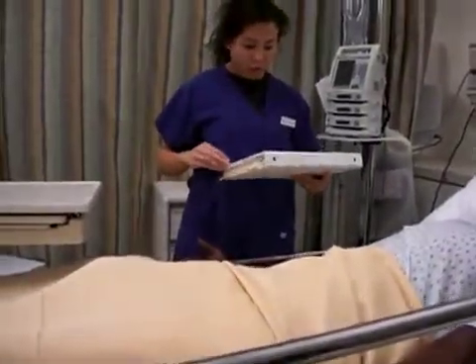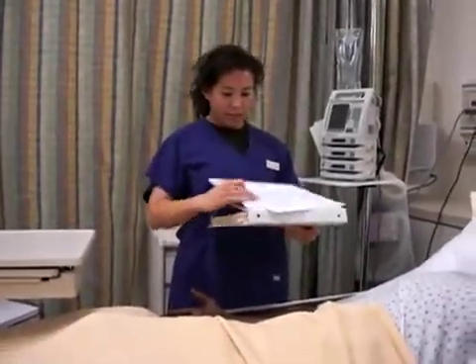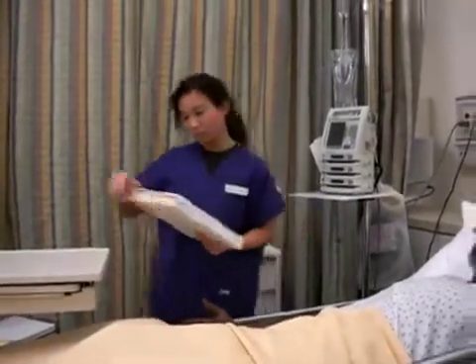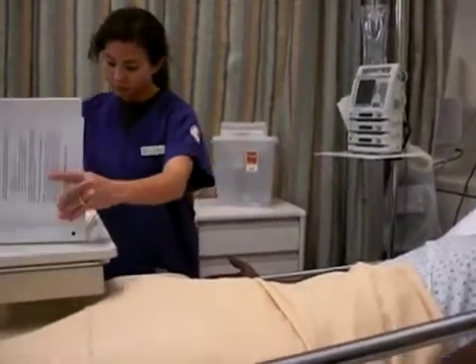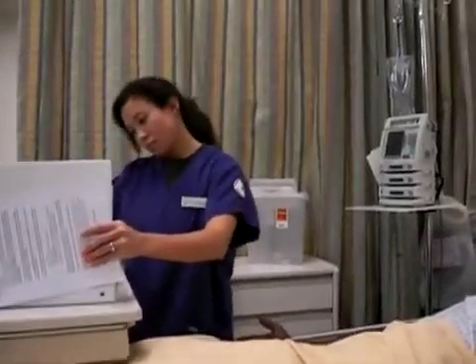I have an order from your doctor that I need to start an IV for you and a medication, nitroglycerin, which is for your chest pain. The nurse reviews the physician's order for the type and amount of IV fluid or medication, with the rate of the fluid administration, and if there are any potential incompatibilities with other drugs.